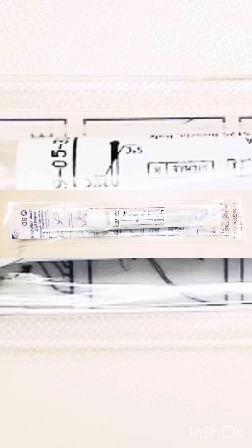And as I mentioned, it is important to use the right type of swab. Even though there are many different brands and many different types, some specific tests may call for a specific type of swab collection kit. And if that kit is not used specifically, then the specimen can be rejected.